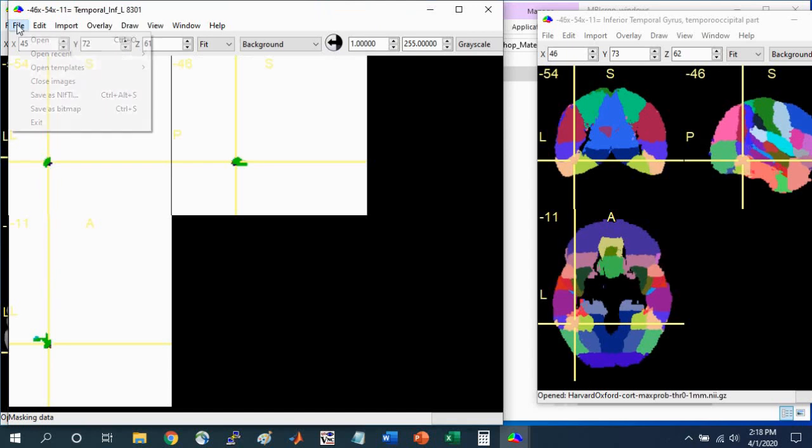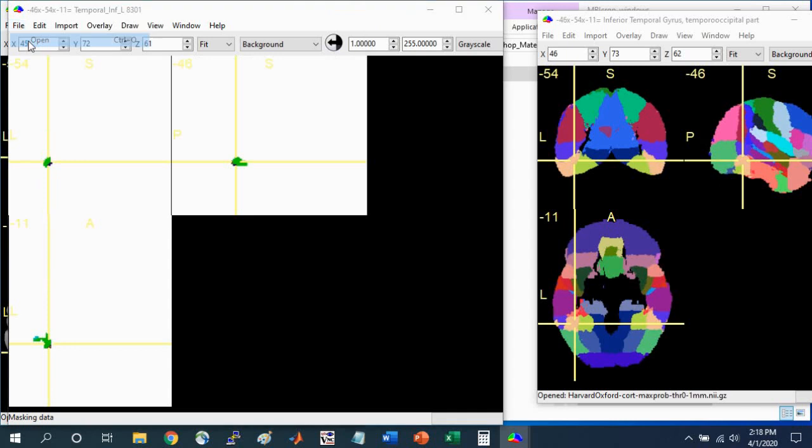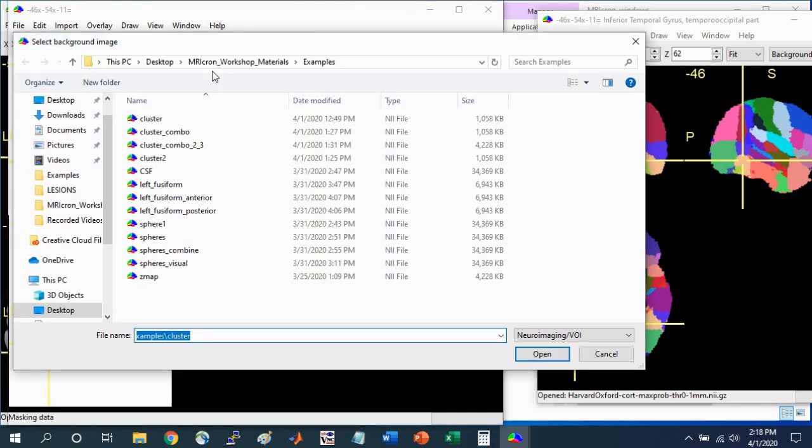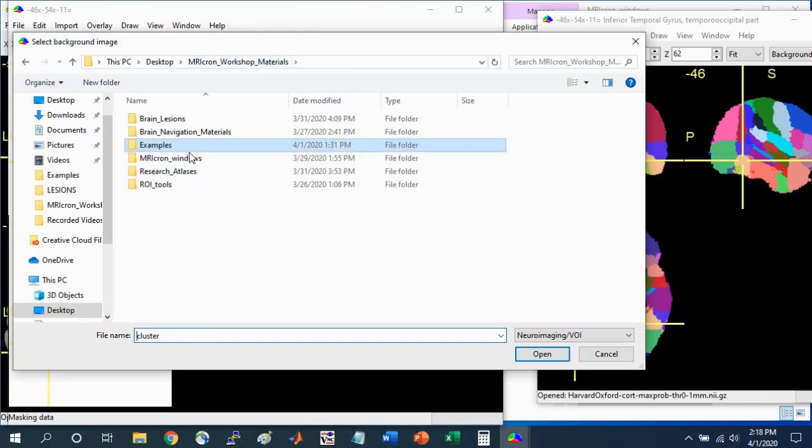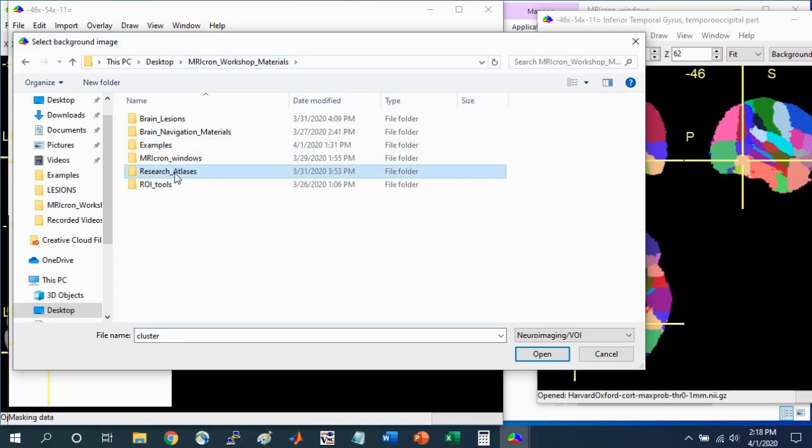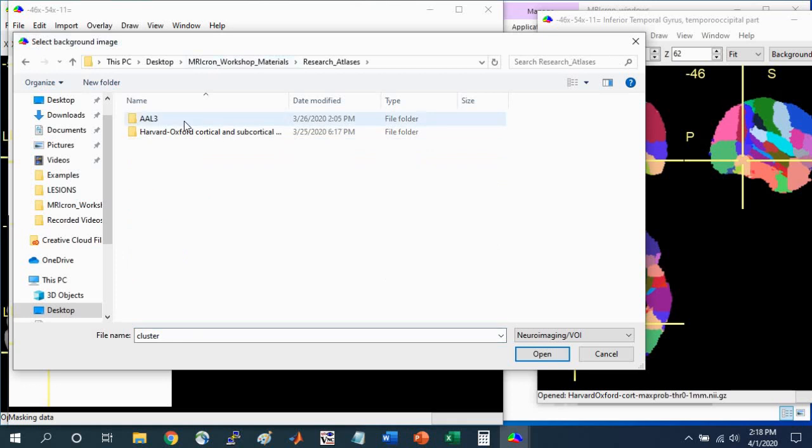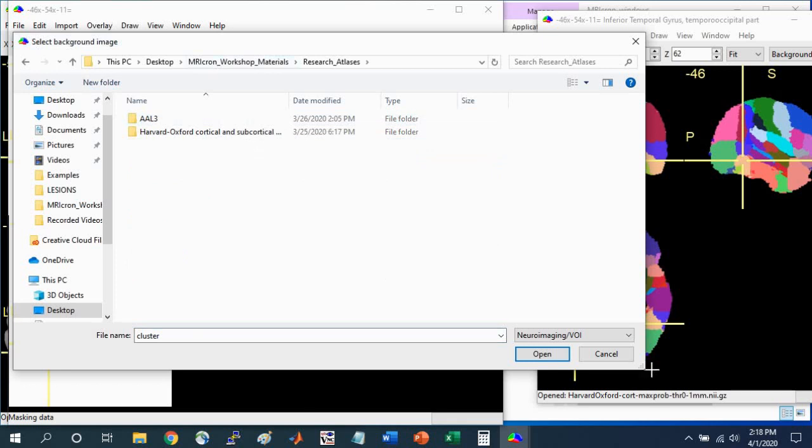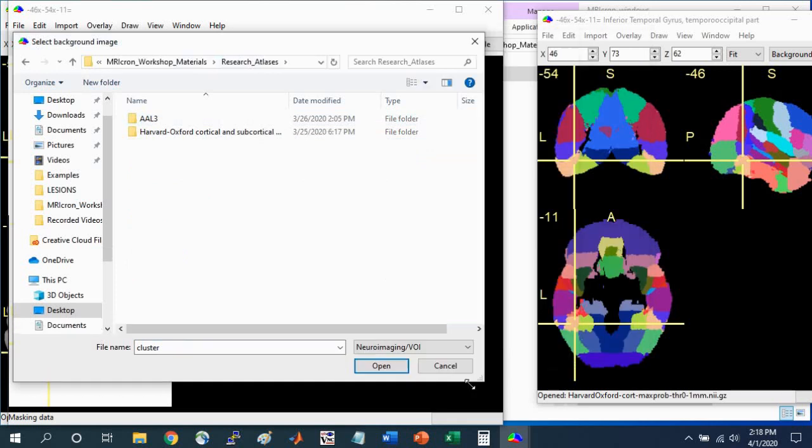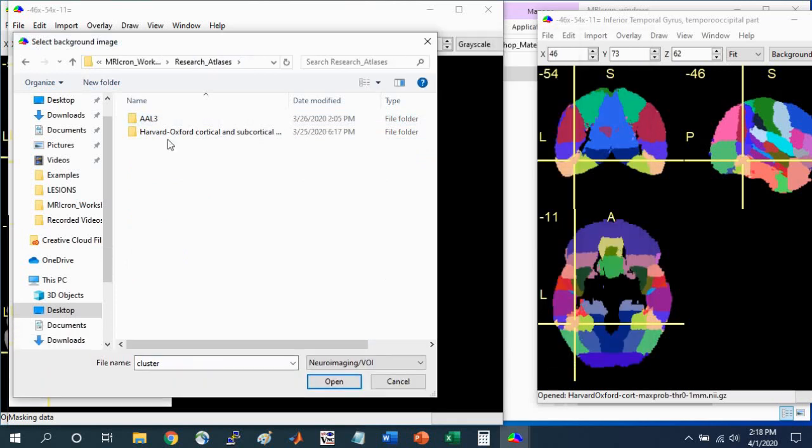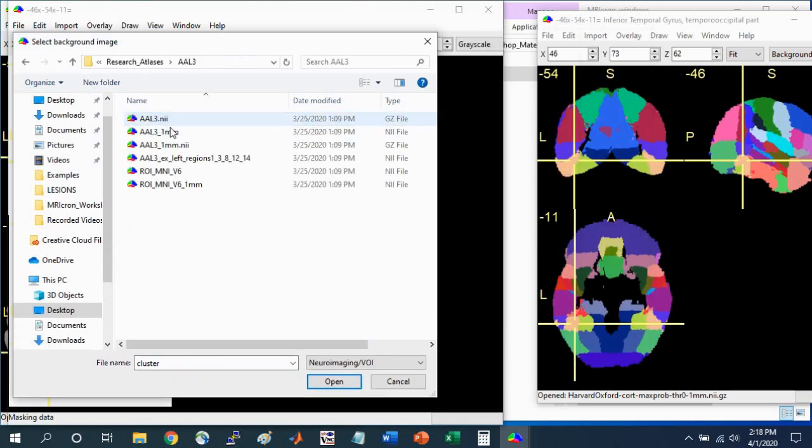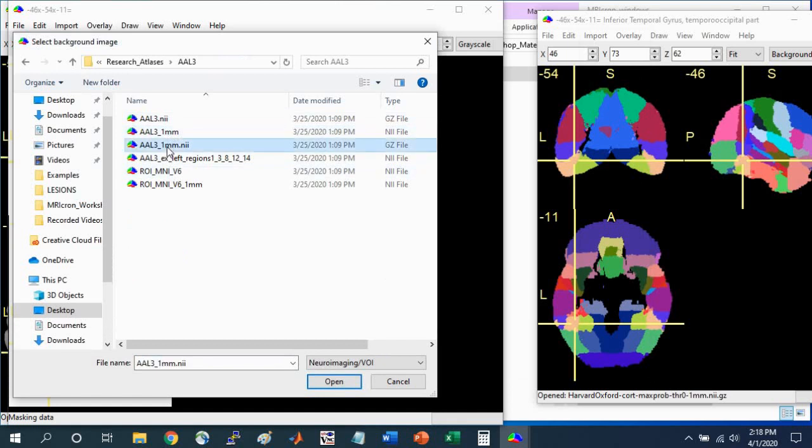Finally I want to show you the materials that come with the workshop materials that you've downloaded. We can go to File, Open, and we can navigate to this Research Atlases folder. We can see that I've already put the AAL3 Atlas, which is a more updated version of the AAL Atlas. Here are different file options for you.